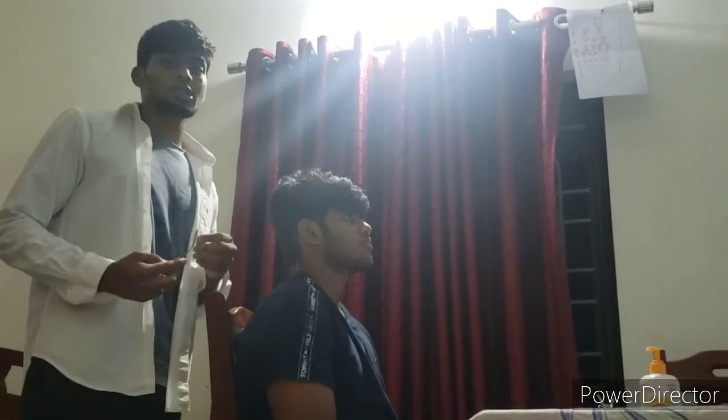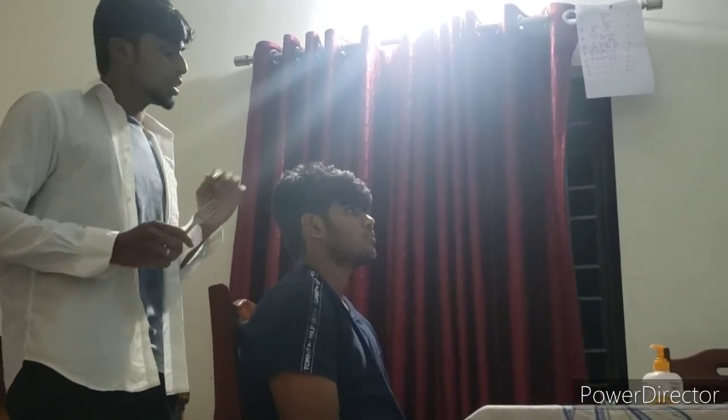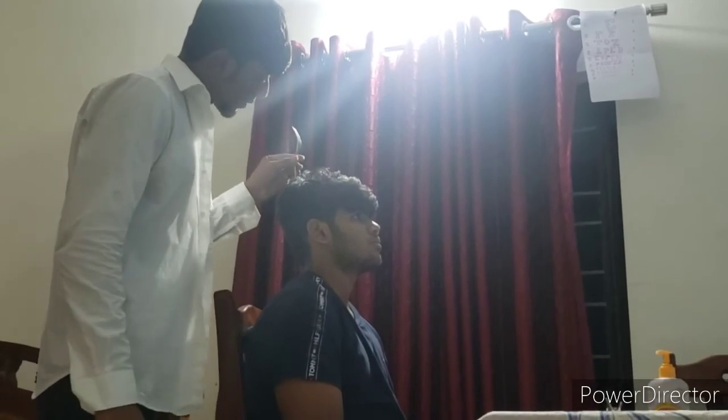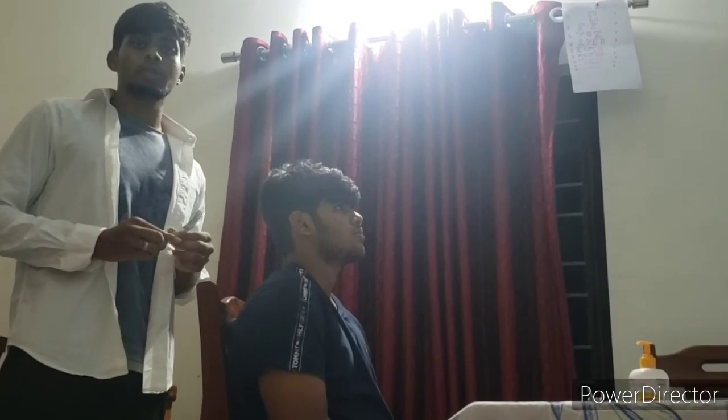Tuning fork test. First, I'm going to do the Weber's test for lateralization. For this, you need a tuning fork of 512 Hertz. I'm going to give a slight vibration to my tuning fork and set it on the midline of the head. Tell me when you hear the vibration stop. If the patient can hear in the impaired ear, then it is conductive hearing loss. If the patient can hear in the unimpaired ear, then it is sensorineural hearing loss.